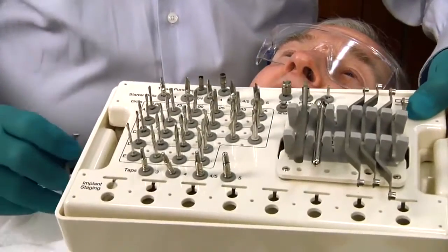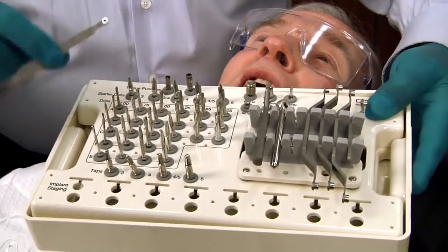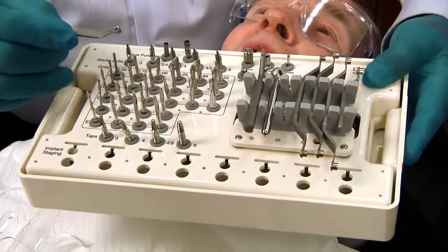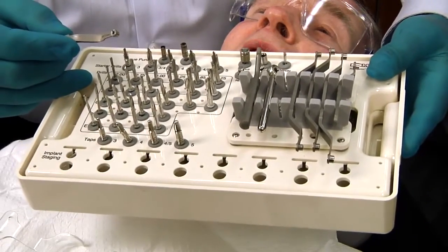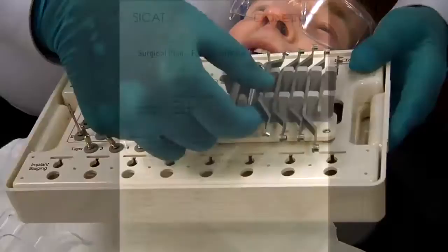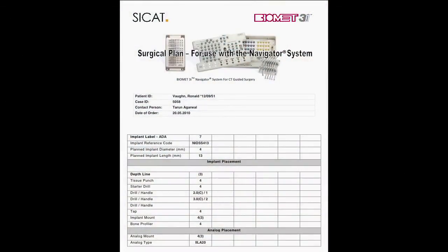So what we can do is we have this two millimeter sleeve that goes inside the master cylinder. Now in that surgical plan that I passed out earlier, the plan shows you which implant sleeve to use.